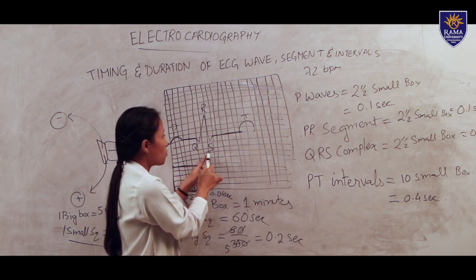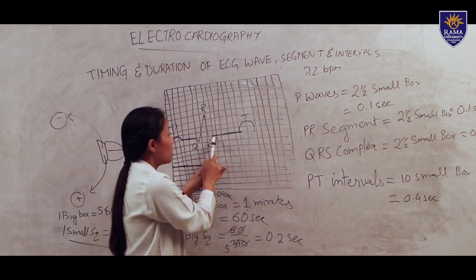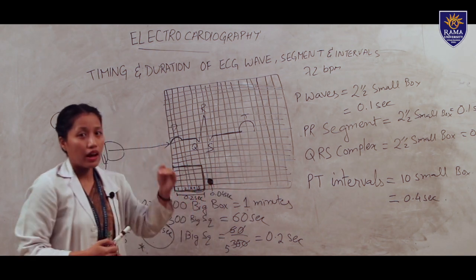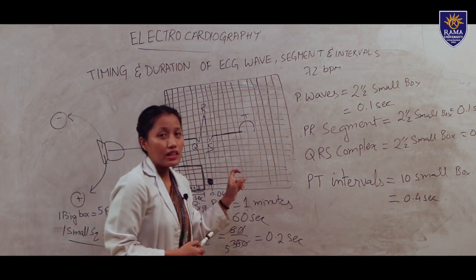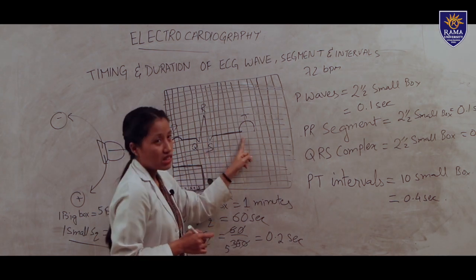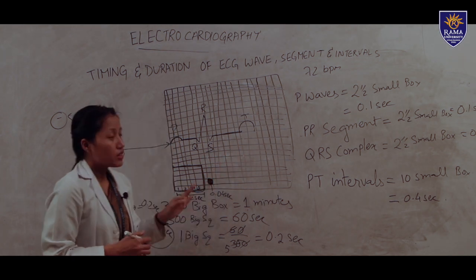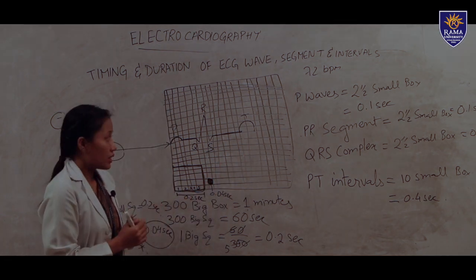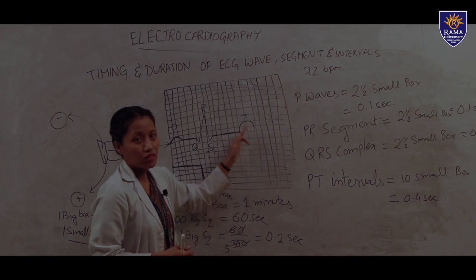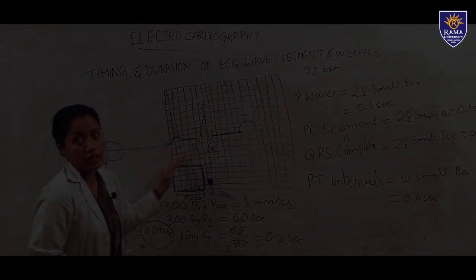After the ventricular depolarization, before the repolarization of the ventricle starts, the heart will not pass any current and will form an isoelectric line. That line we know as the ST segment. After the formation of the ST segment, the ventricle will be repolarized and will produce a T wave. These are the electrical activities in the heart during 1 cardiac cycle.